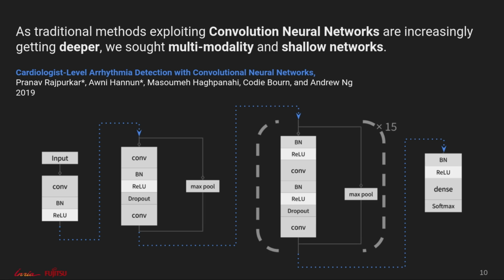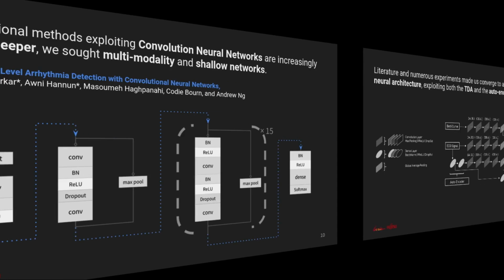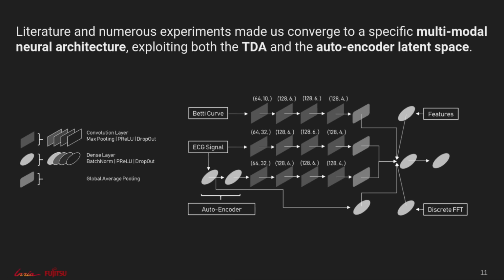We believe that due to the non-practical implications of such models, e.g. medical device embedding or huge training cost, those performances could be achieved with workarounds and shallow neural networks. Well, the transition requires one to actually provide better inputs to the model than the raw ECGs themselves. But both these two last observations made us converge to the architecture now displayed on your screen.